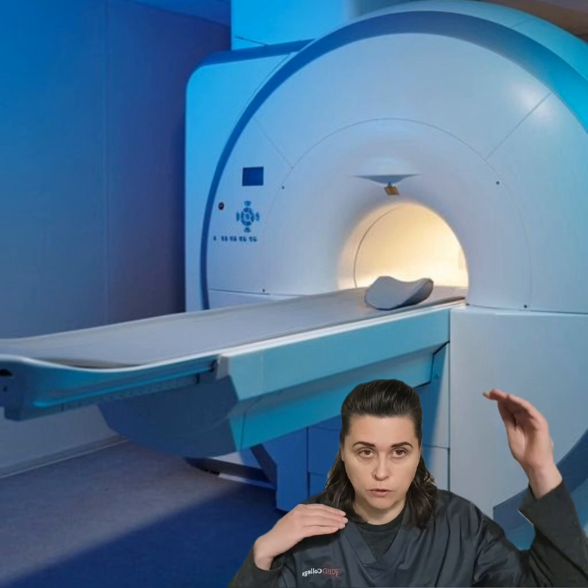For sagittal planning, I will be using coronal plane, and all I will be doing with angulation is to run it parallel to the spinal cord. The field of view will be including from pons all the way to T4.